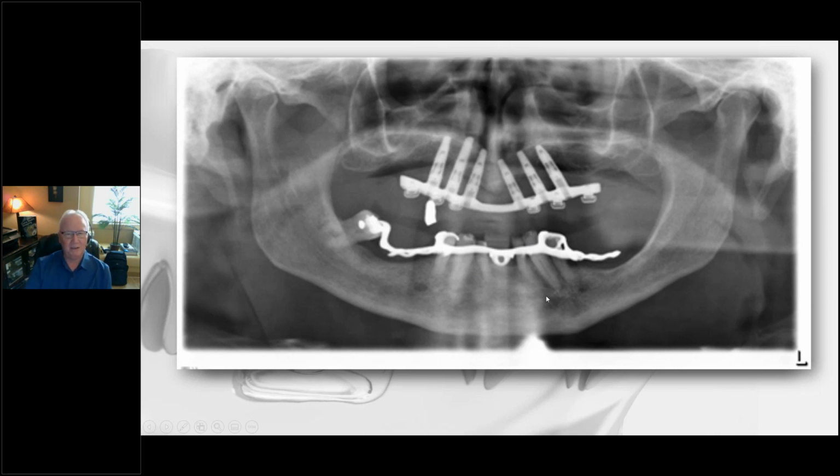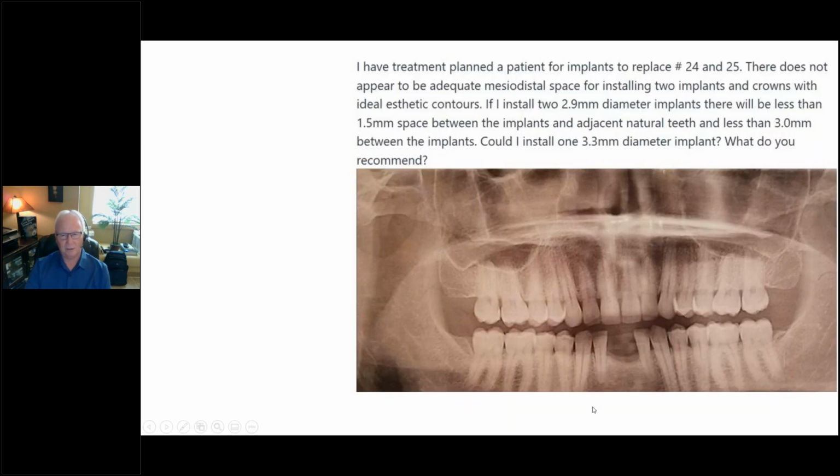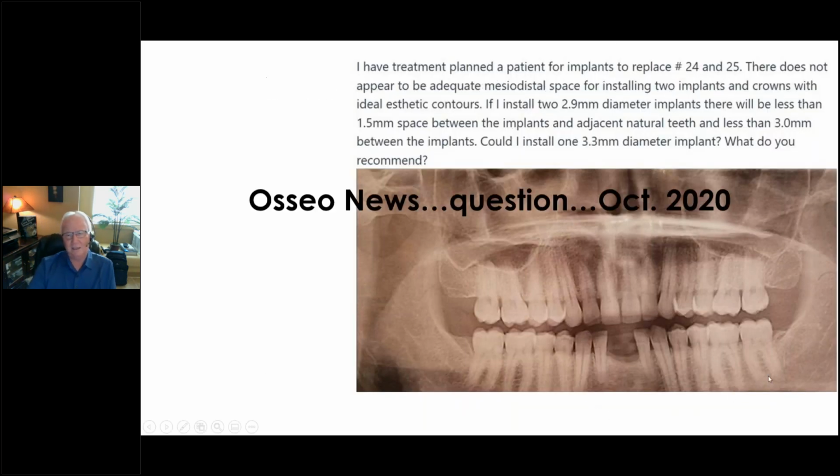This was the type of imaging we used to be dependent on, panoramic and intraoral. Then some people, the high-end ones on the cutting edge, would say, I do CT and send it to the implant company, and they give me back this data that I can make accurate measurements with. I put an overlay on or whatever. We've gone so far past that with these implant software programs now, and with surgical guides, we can place these almost with impunity. But I still see this kind of stuff.